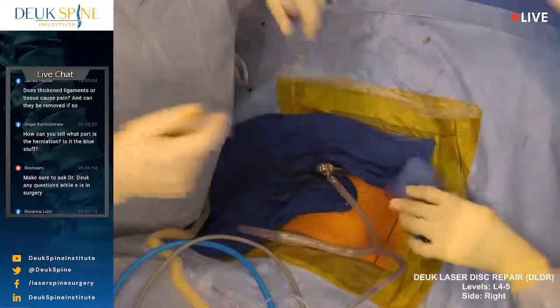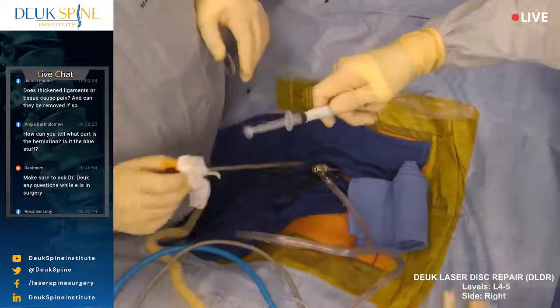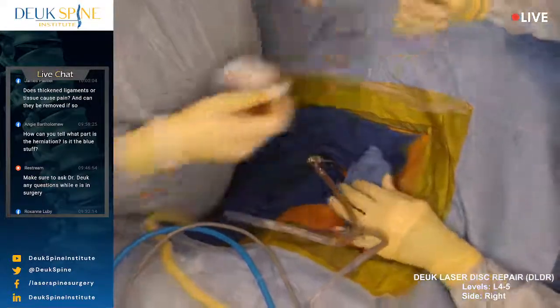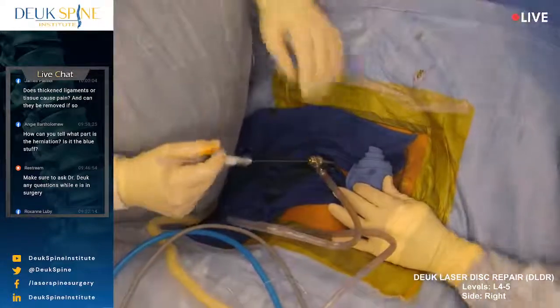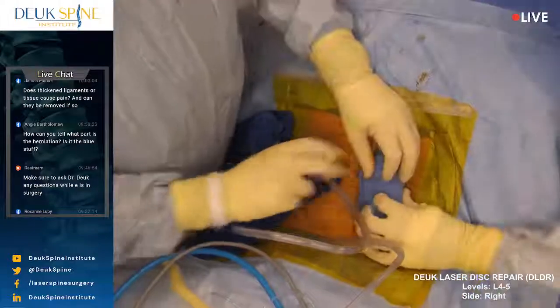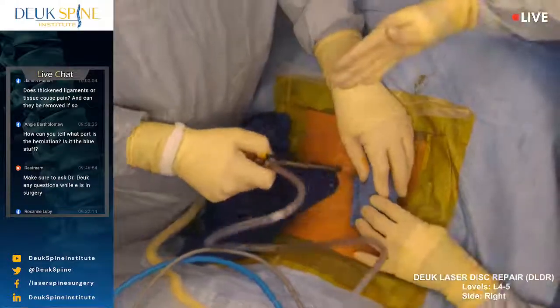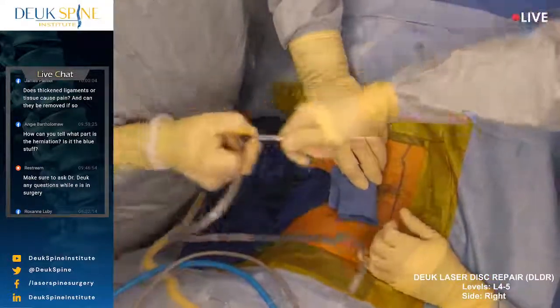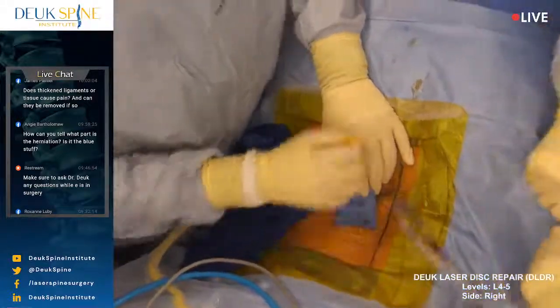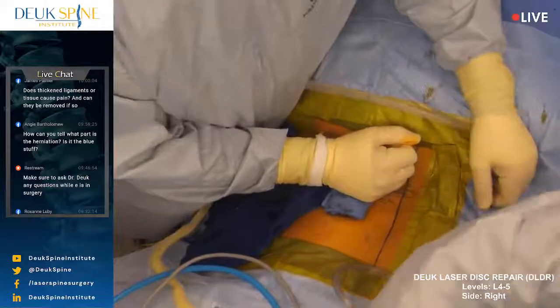Almost done. Lay still, you're doing good. Yeah, he's not happy that the tube's still there. All right. Lay still, you're fine. We're done. Just lay still.